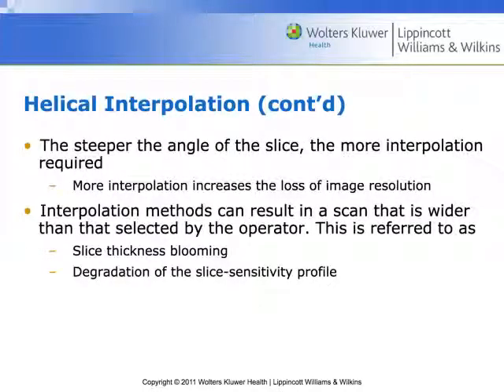So as we angle the slices on this, I mentioned one of the advantages of axial scanning is that we can angle the gantry. For example, for a routine brain, we can angle the gantry, and we are not asking the computer to do anything too crazy to get us information from that, right? Because it's still stepping and shooting, just at an angle. If we angle this volumetric data set, it changes everything, right? It changes literally everything. If you can imagine that roll of spiral slice, if you tilt it on its side, a lot of the angulation and everything changes with it. So its ability to interpolate between different points is going to be lost.